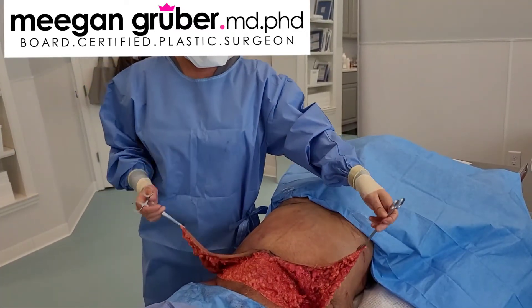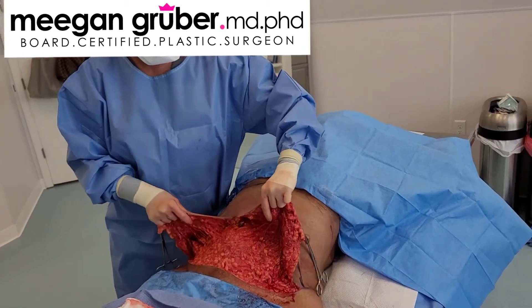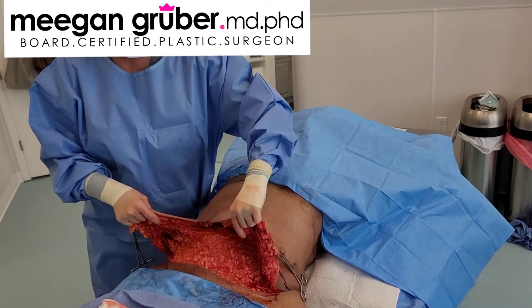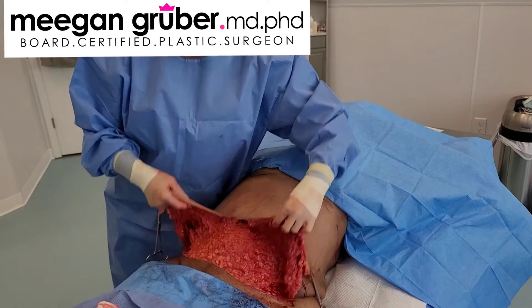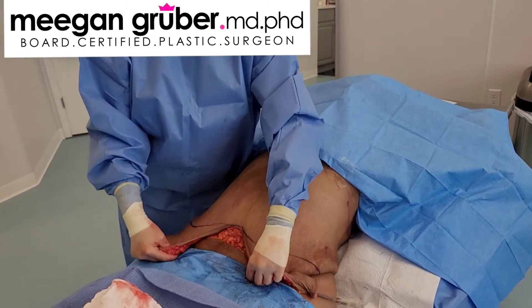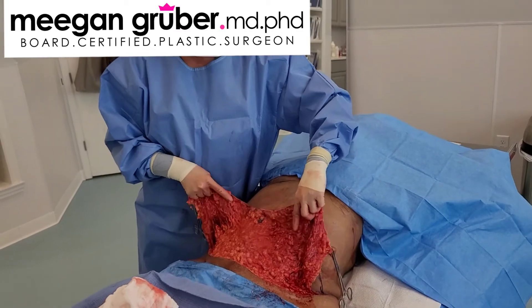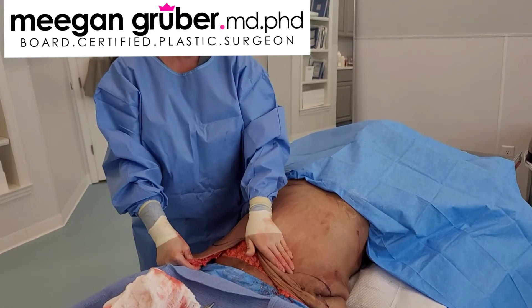So this is the full tummy tuck dissection. You can see it's still connected — this is the key to doing this. It's still connected all the way up to where we're going to cut it. We're going to cut it on this blue line, and it's still connected to her there, just like lipo would be. You don't want to disconnect everything further up than where you're going to cut it because this all needs good blood supply.